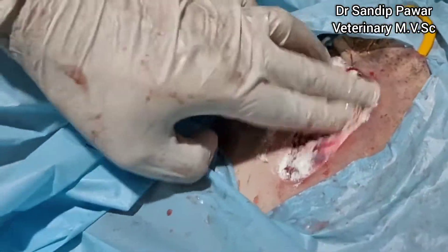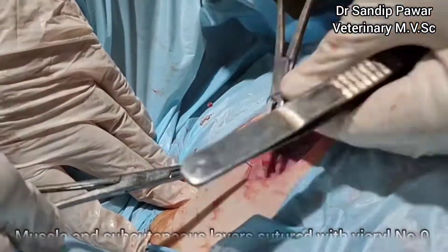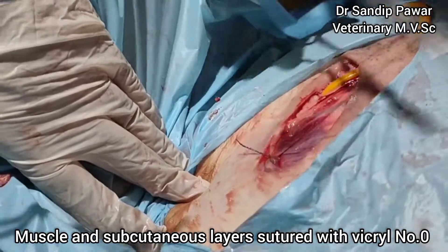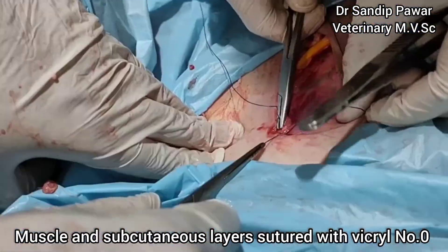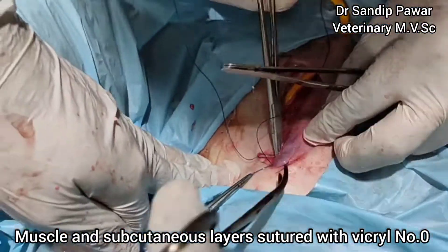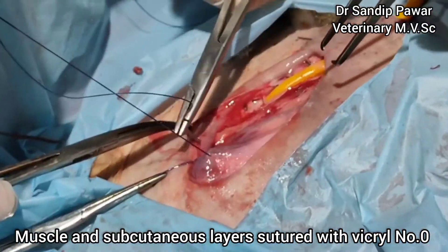After that, muscles and subcutaneous layers are sutured with vicryl number 0 as a suture material.